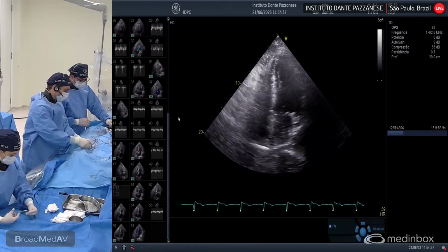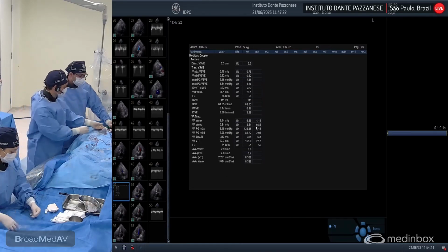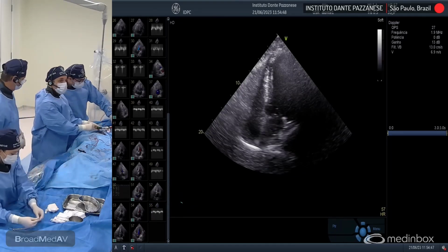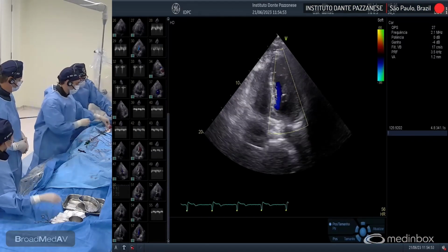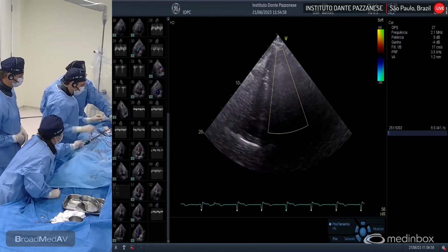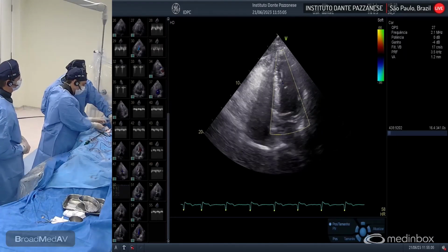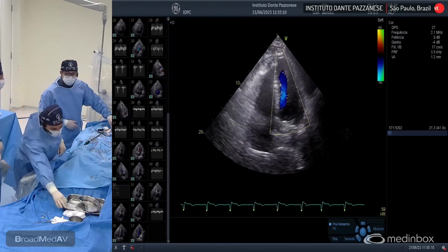There is no pericardial effusion, and we can also see the results in the hemodynamics, the way we showed you, the minimum gradient, and there is no exacerbation of the ventricular gradient, looking for some suicide ventricle or something like that. So it has to be complete, not only to see the valve, but to see the whole. Great. So are you quite satisfied with this kind of result?